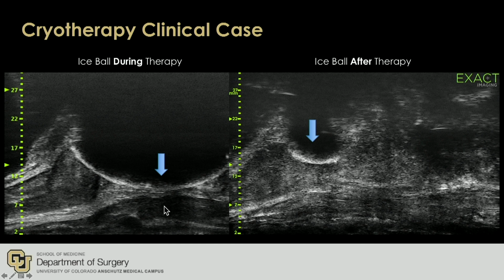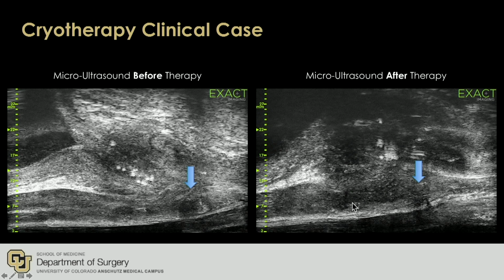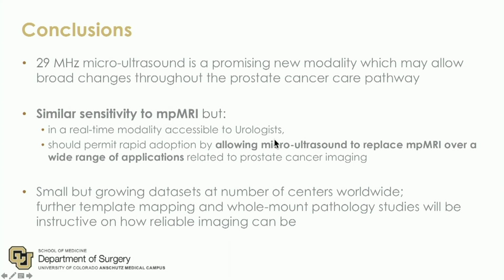So we can play chicken with the rectum a little bit more, I think, than we have in the past with our standard ultrasound. And then that lesion that I told you about, we tried to nail it with the cryo, but we didn't. I don't think we got the whole thing.